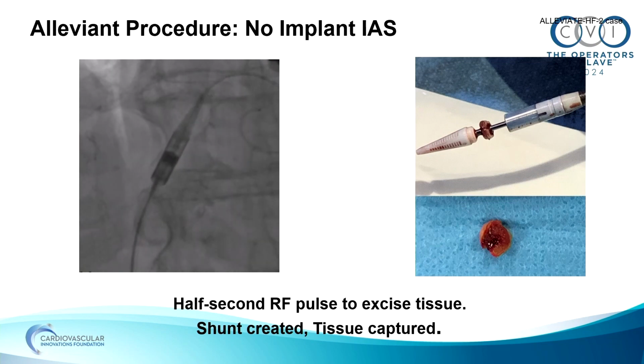In the pivotal trial, we'll actually have 500 or 600 atrial plugs like that, which Stephen's colleague Kavita Sharma and a committee, along with David Cass, will be studying. We'll learn a lot about atrial tissue that I don't think we've ever known much about before.